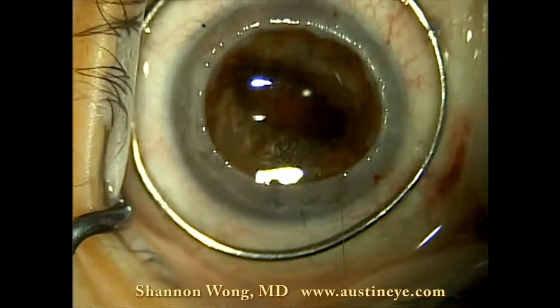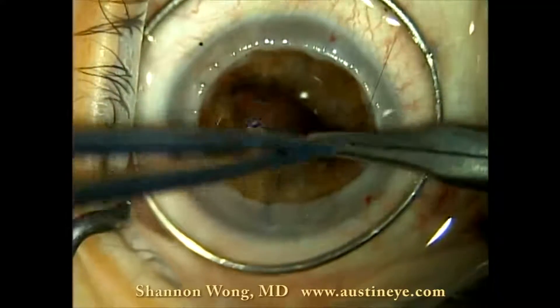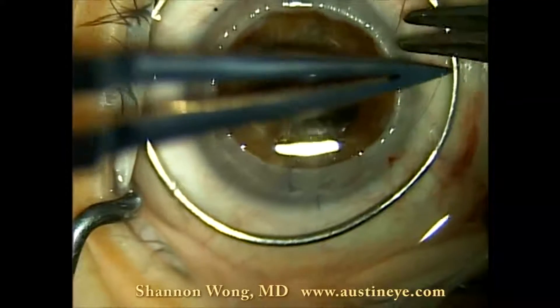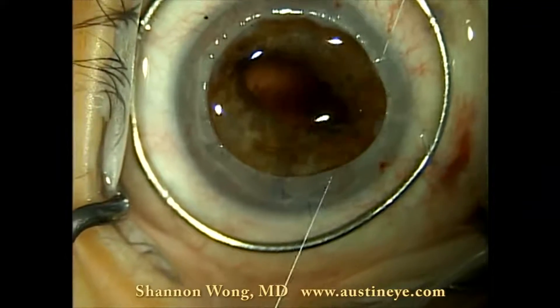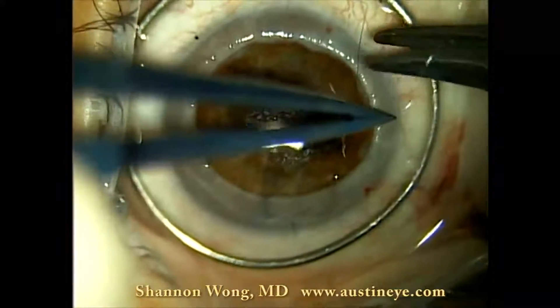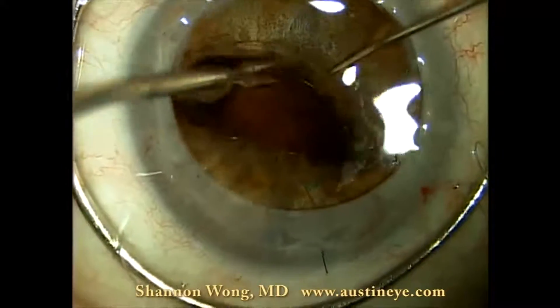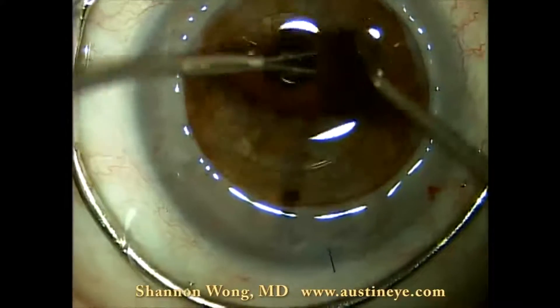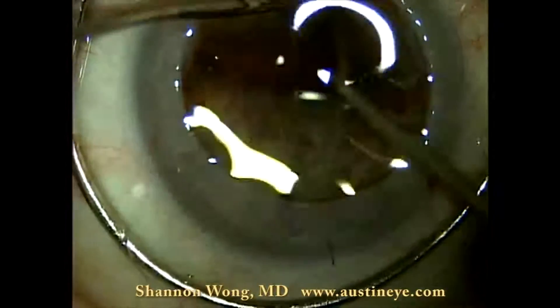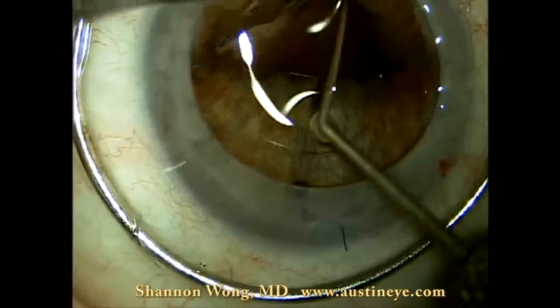Now that we've secured this lens to the iris, we then decide to use a cyclodialysis spatula to pop the optic posterior to the iris plane. The technique reminds me of repairing a bicycle tire wheel — we use the cyclodialysis spatula to position the lens posterior to the iris, akin to placing the rubber tire behind the rim of the bicycle wheel.